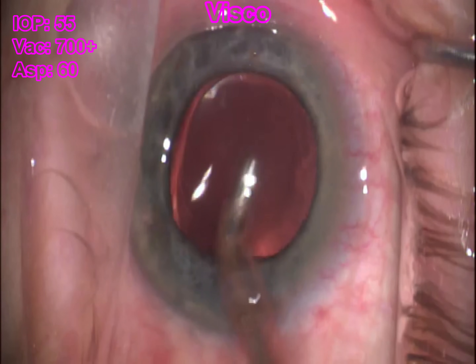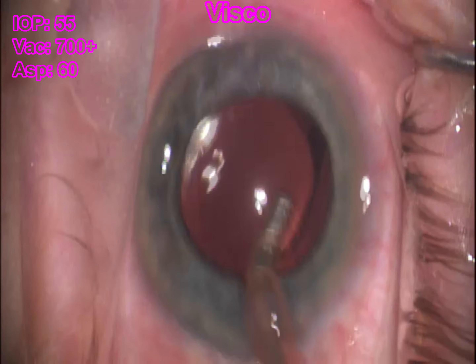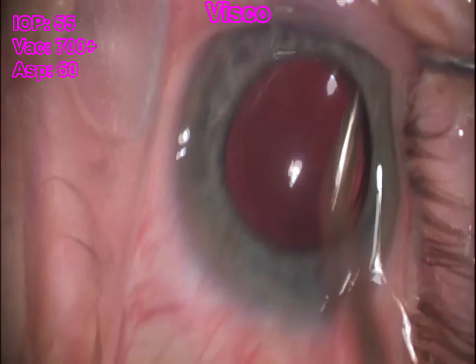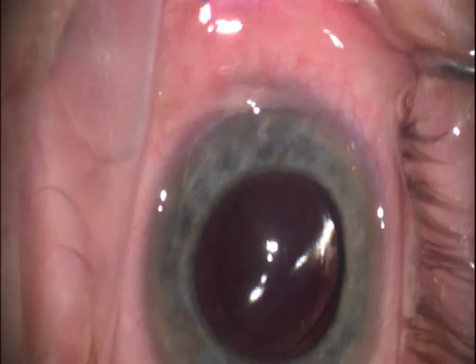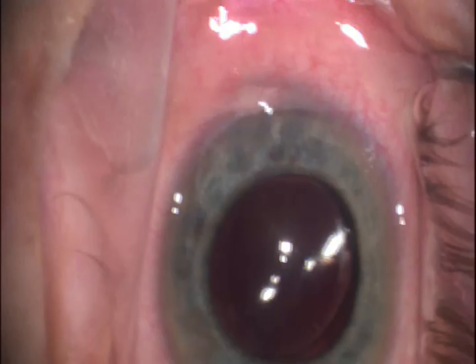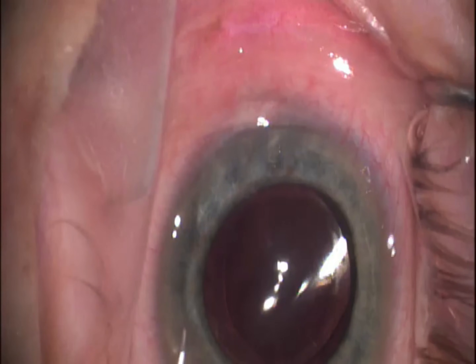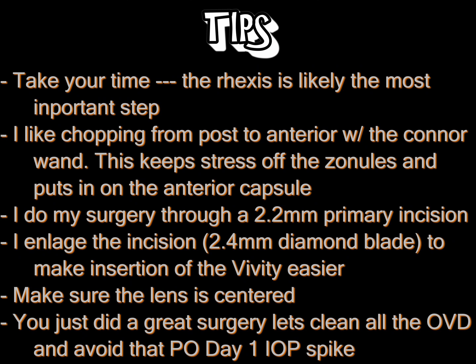My goal is to make sure we don't have an IOP spike on day one. The lens is nice and centered — it looks really good, and you can see that central donut there. At this point we're just going to hydrate the wounds with BSS, make sure we don't have any leaks, and we are done. Thank you very much for taking the time to watch the video.